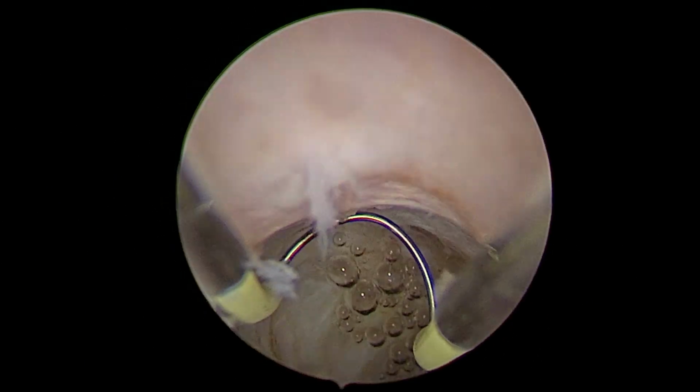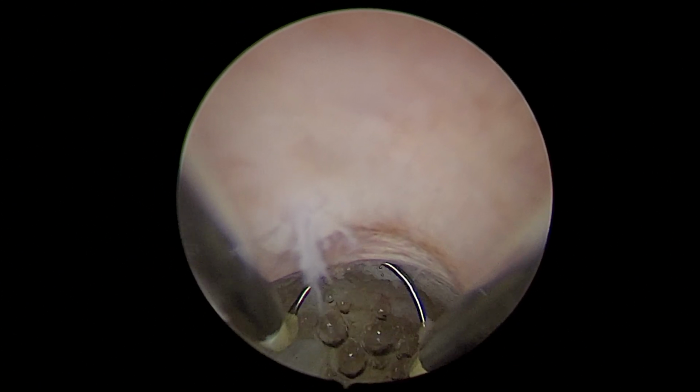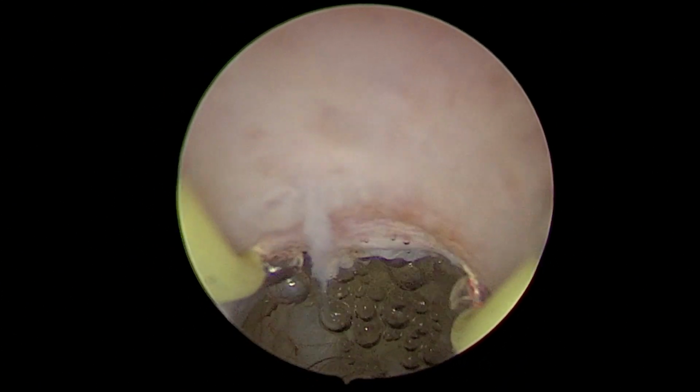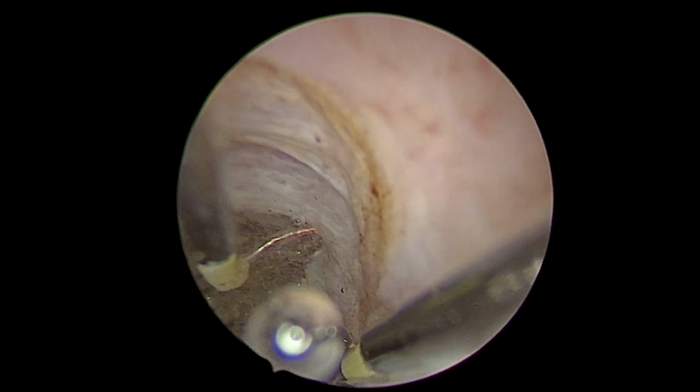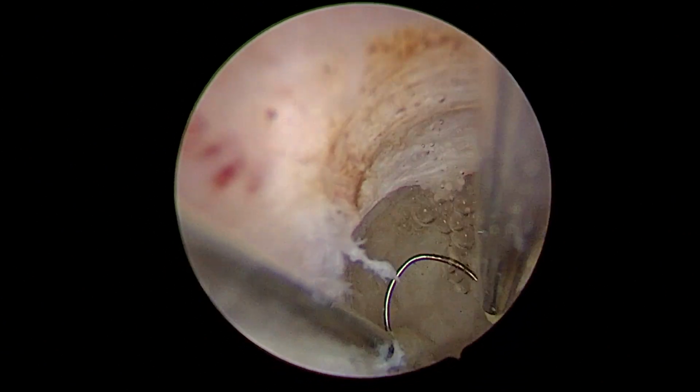Now here we again come out of the isthmocele into the cervical canal, and we have a look at the depth of the isthmocele. If not, then we make the angle more soft.